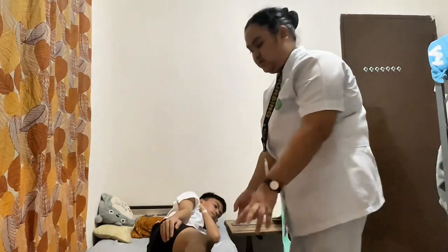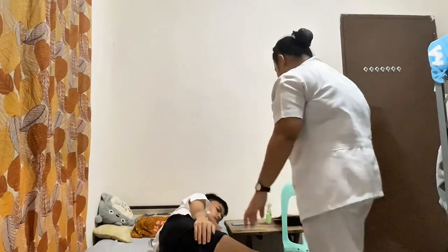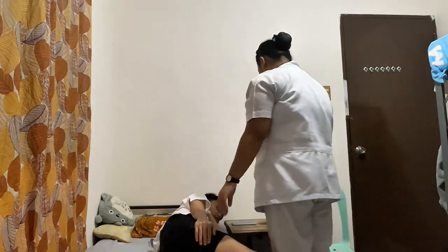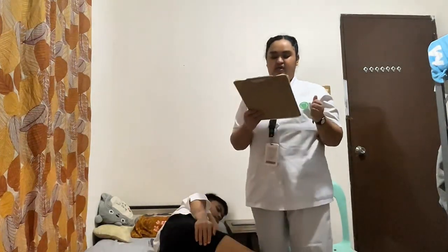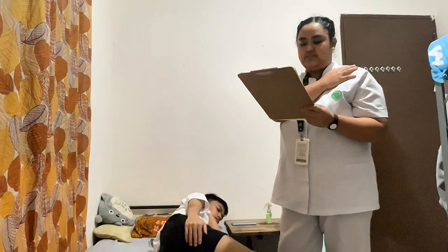So next is to adjust the patient's legs. So I already placed one arm under the client's leg and one behind the client's back. I will allow the patient to dangle for 2 to 5 minutes.